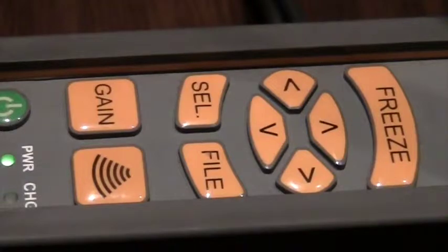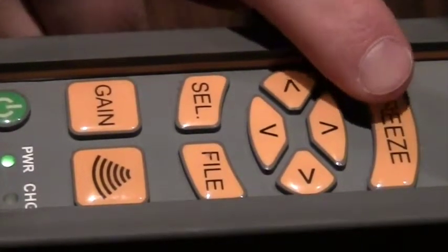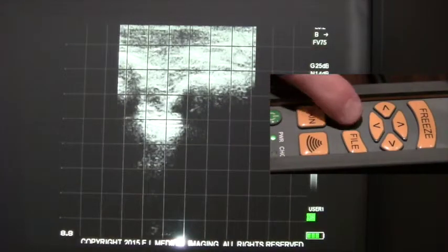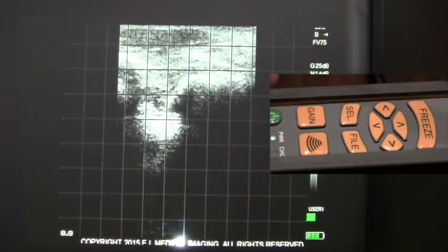To measure on the IBEX light, once your image is acquired, press the freeze key. Once the image is frozen, press the select key to bring up the measurement menu.